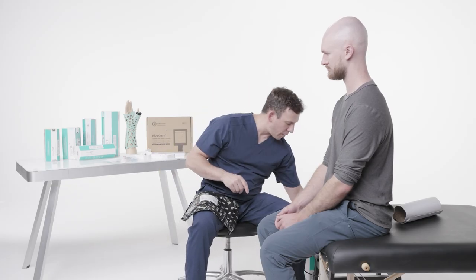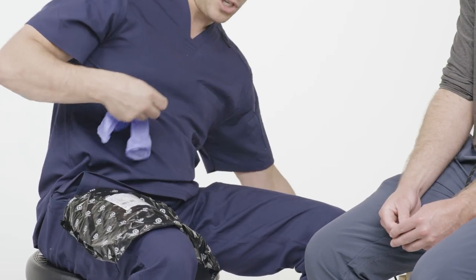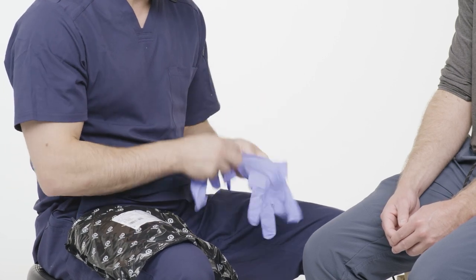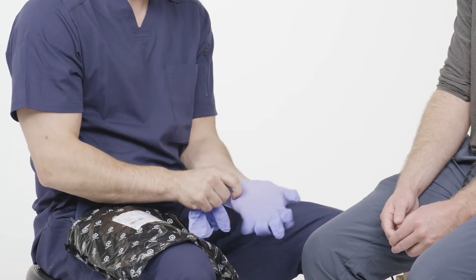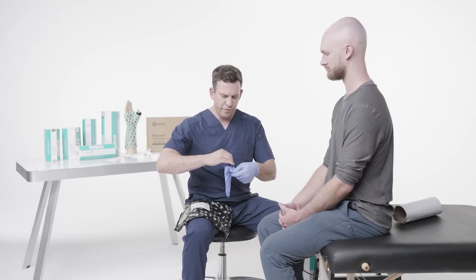Before I open this up, I want to make sure I protect myself and put on gloves, just in case there's any kind of leakage out of the silicone so I don't get it on my hands. I'm putting on my gloves now.